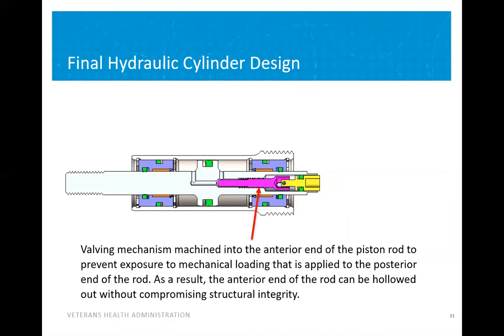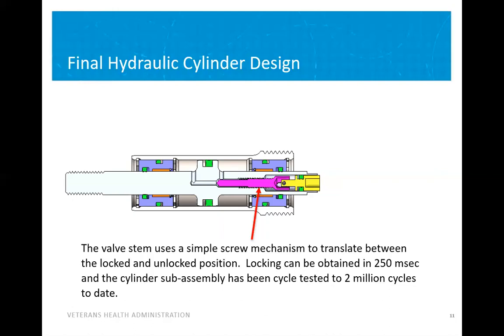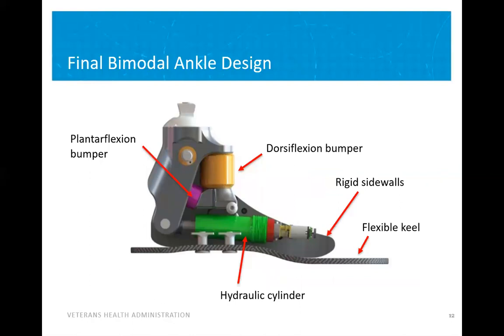We incorporated the valving mechanism into the anterior end of the piston, which did not experience the same forces the posterior end experienced. We were also able to lock and unlock the ankle using a screw mechanism to change the position of the valve stem. When we look at the final bimodal ankle design, there are a few key elements: bumpers that control both the plantar flexion and dorsiflexion, a rigid sidewall that overlaps a flexible keel, and the hydraulic cylinder that fits nicely into the foot frame.